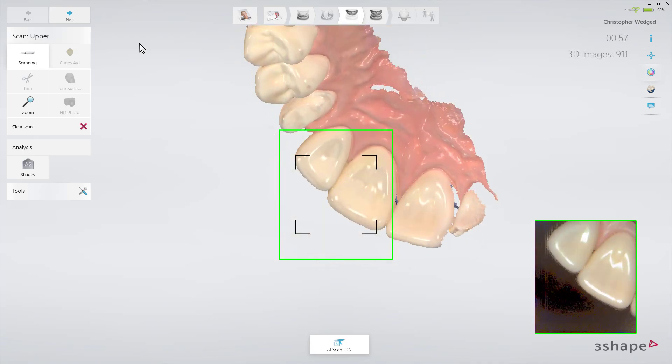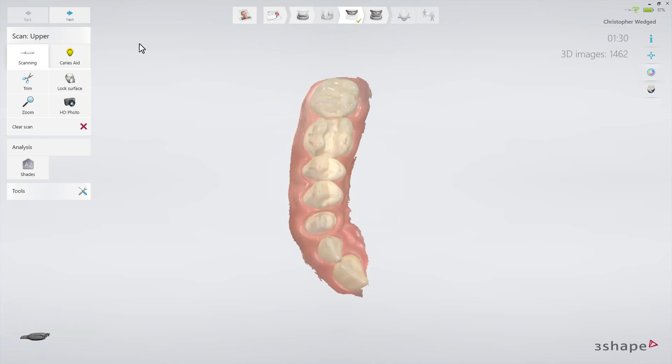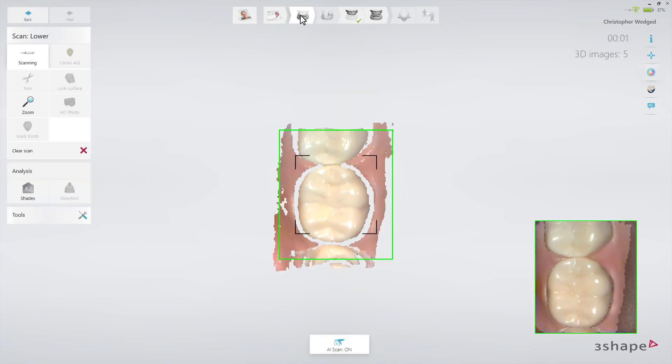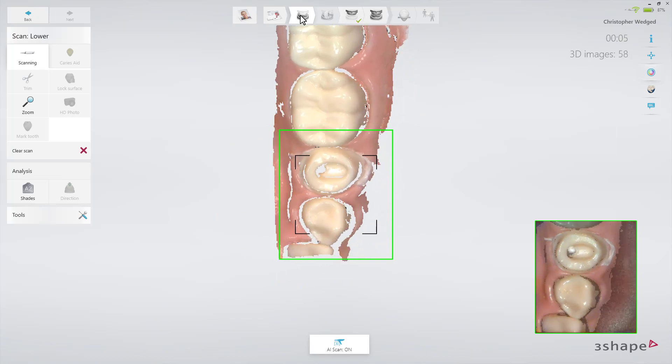While scanning, follow the official scan strategy. Now scan the lower arch without the scan post. It's important to scan the same area as in the upper jaw for the best possible bite later on.